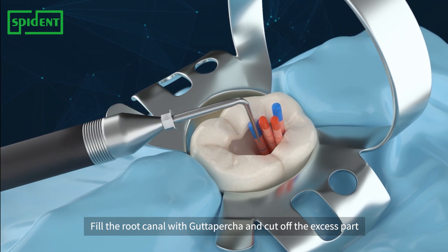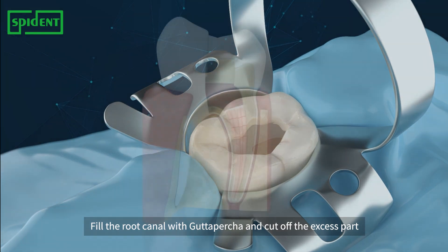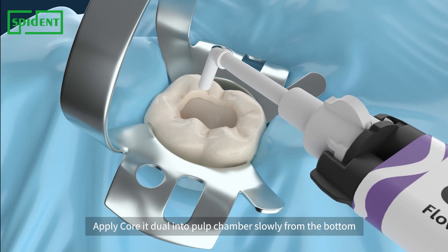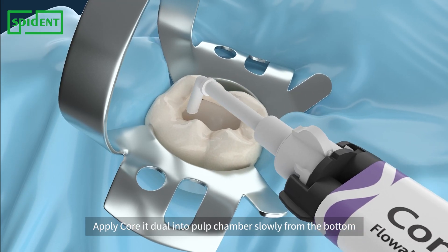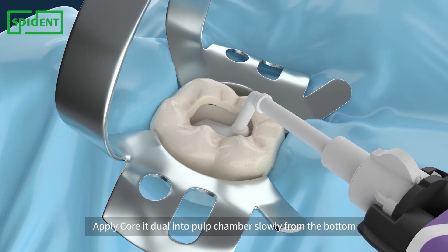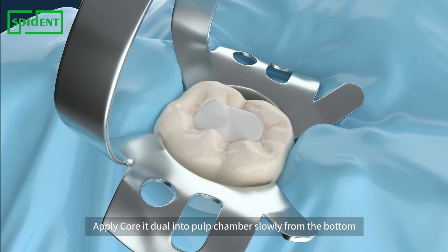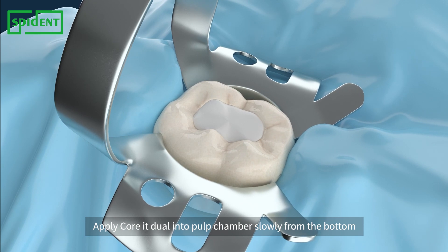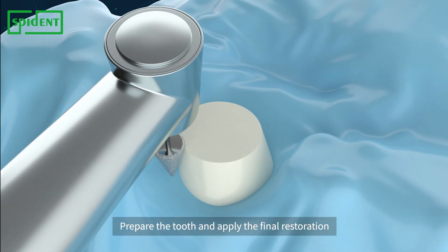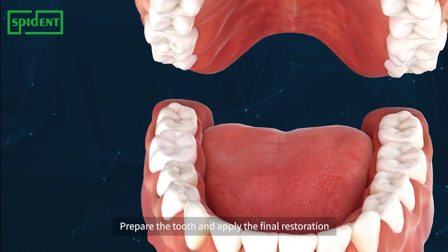Cut off the gutta-percha so that you have chamber space to work on post and core. After root canal treatment, the tooth becomes weak — use post and core with dual-cure composite for buildup before the crown. After core buildup, check the occlusion and finish the whole process.